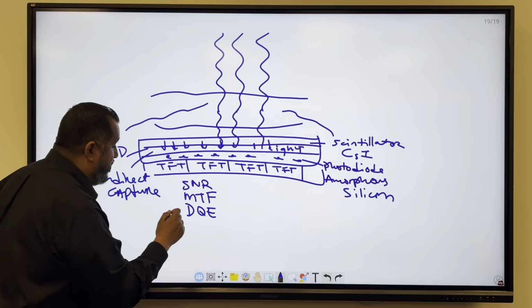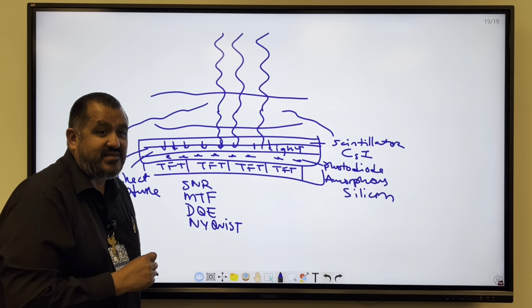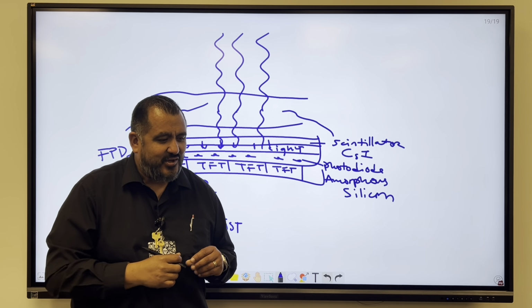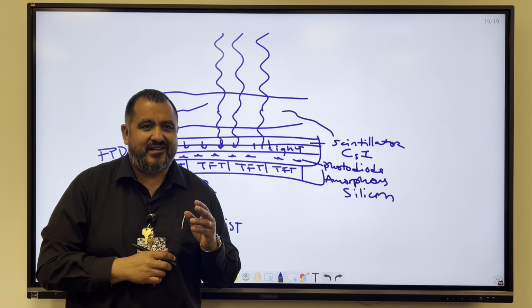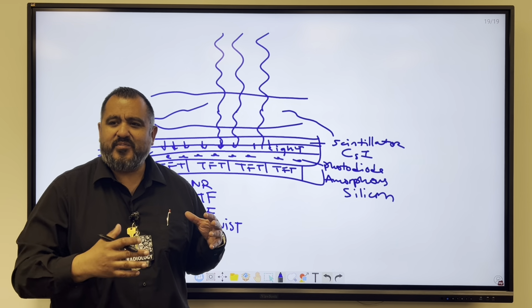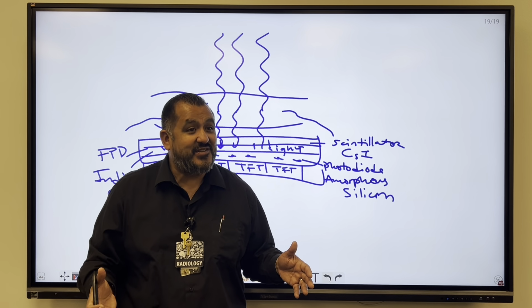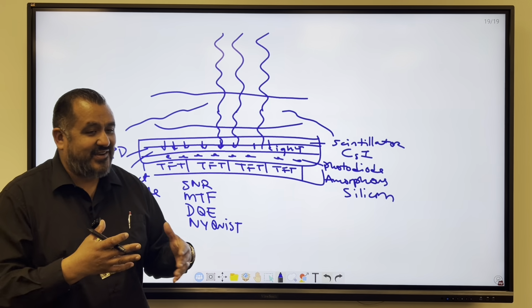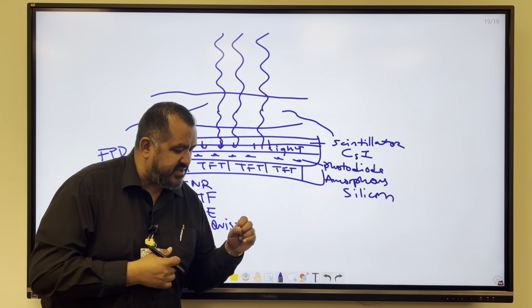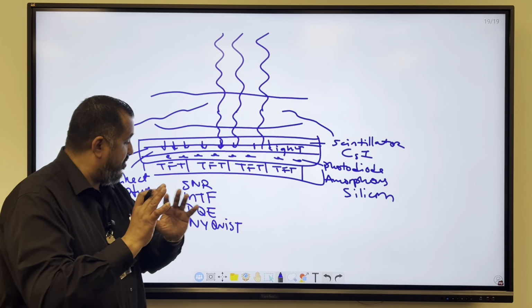We have the Nyquist theorem occurring, all right? So again, we have to have twice the sampling of the bandwidth, correct? I love this analogy for Nyquist. You measure twice, you cut once. I love that. One of my students was a carpenter, and he said, Mr. Ram, in carpentry, we say we have to measure twice before we cut it, so we don't have any issues of cutting incorrectly. So Nyquist theorem is sometimes known as the Nyquist criteria, or the Nyquist theory, all the same thing.